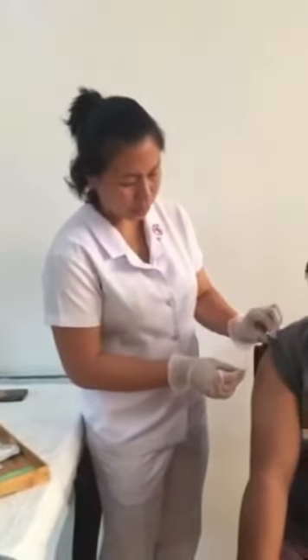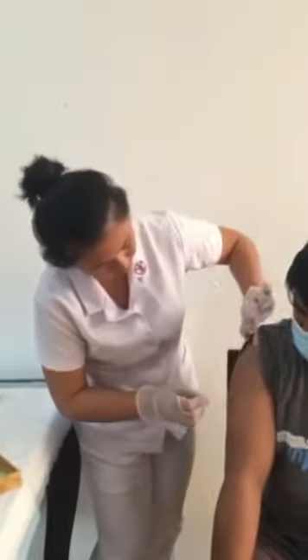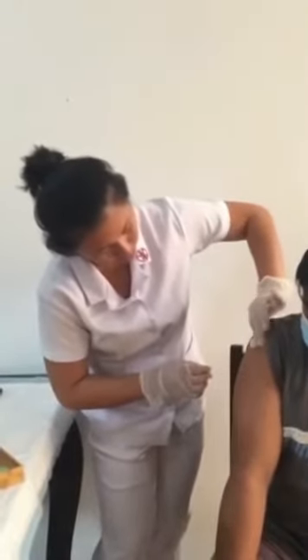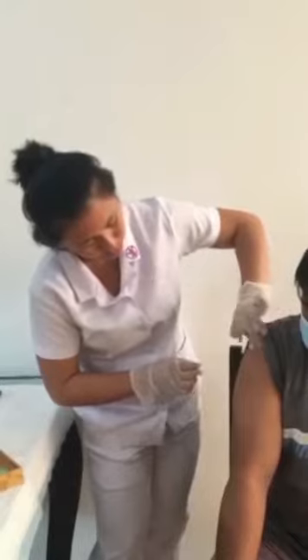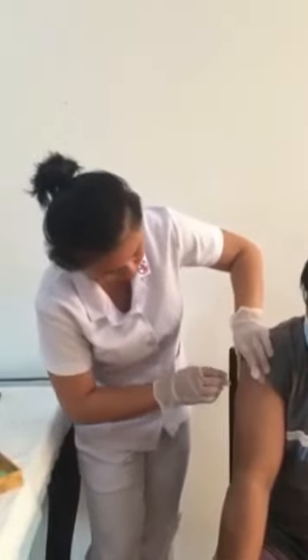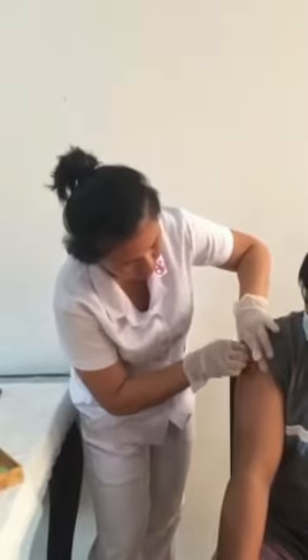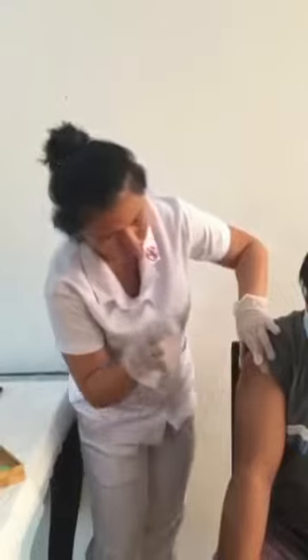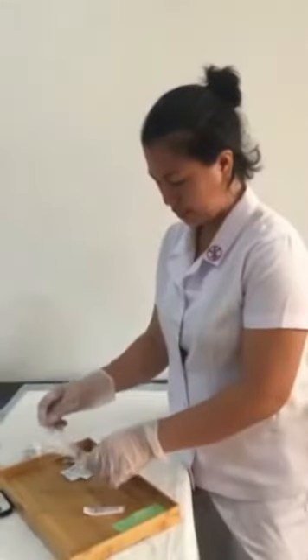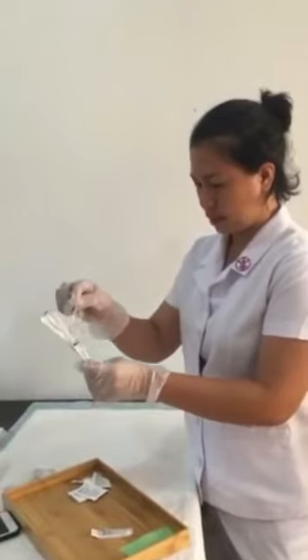Opening the swab, cleaning it from inward to outward in circular motion. So from here, the deltoid, the site, and this part. Allow skin to dry prior to injecting medication. This will help reduce the discomfort of the injection.